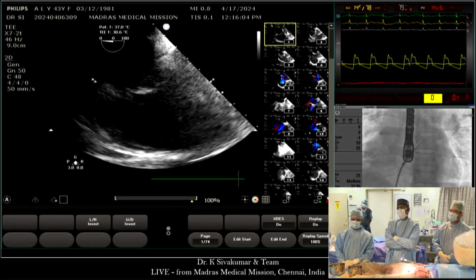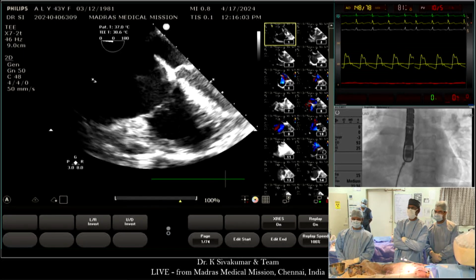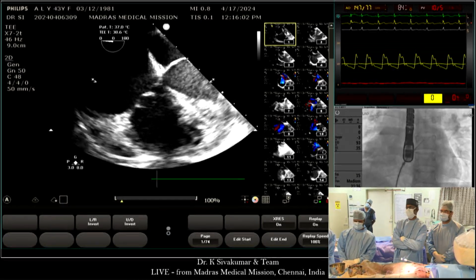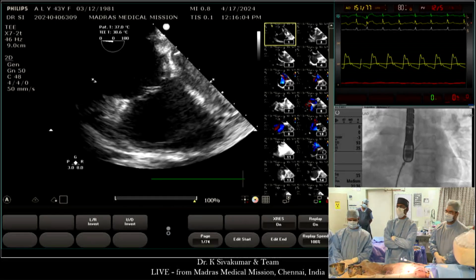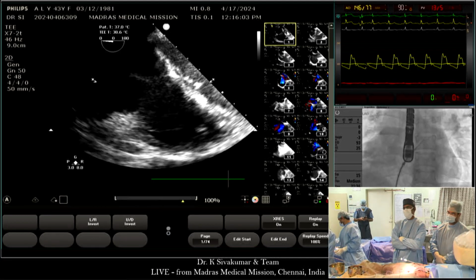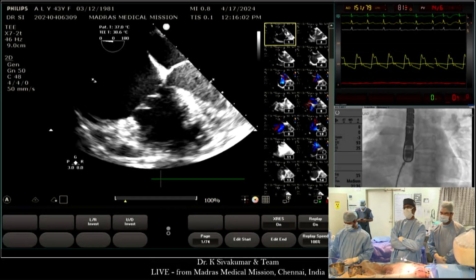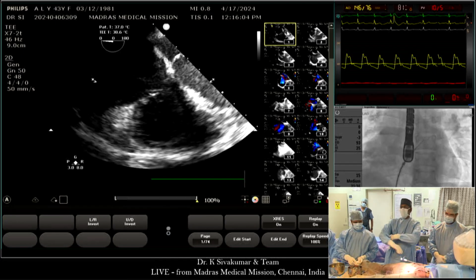Anyhow, now the strategy that we follow: we have completed 135 patients of sinus venosus defects so far, and our incidence of an additional right upper pulmonary vein draining above the main right upper pulmonary vein is close to 15% among the cohort of 135 patients. Previously, we used to mount an uncovered stent on the top and a covered stent on the bottom simultaneously on a long balloon, positioning the uncovered portion to straddle the additional upper pulmonary vein and the covered portion to straddle the lower pulmonary vein.